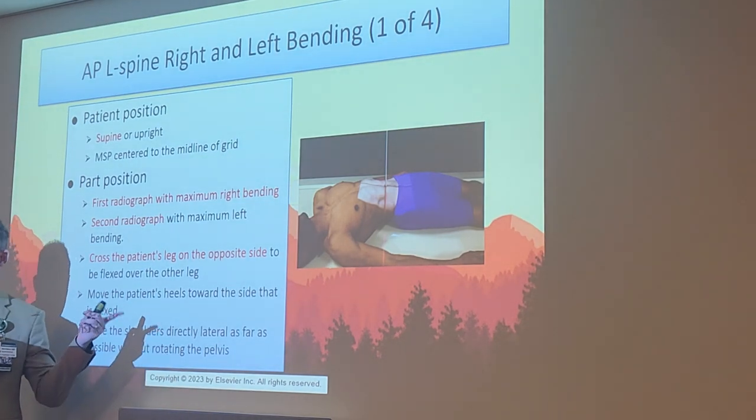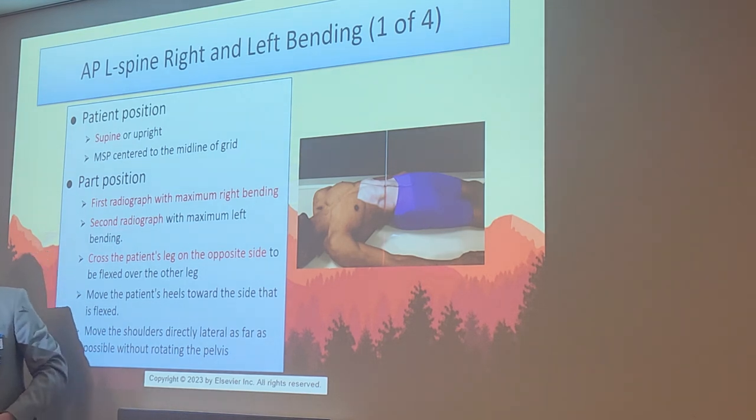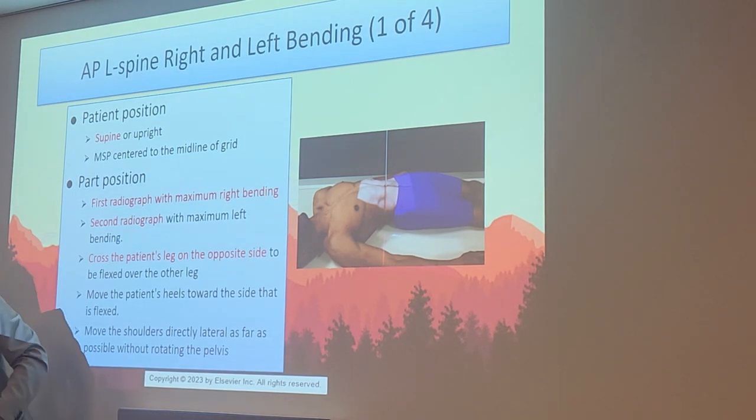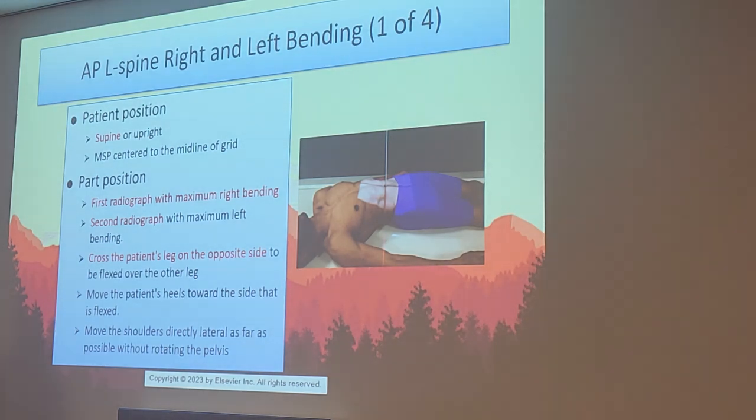The hardest part about doing this is you've got to rotate the top of the body without actually moving the pelvis. So you're going to bend as much as possible while keeping that pelvis as flat in the same spot as you can. Because naturally when you do this, you're going to move their hips. See, but you got to do it without moving the hips. It's a very challenging x-ray. I've actually never done one of these, but I can imagine it'd be very challenging. It looks weird. It does look weird.